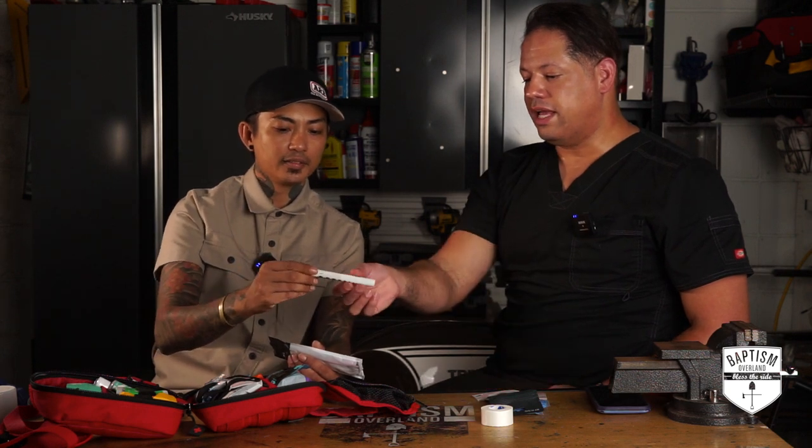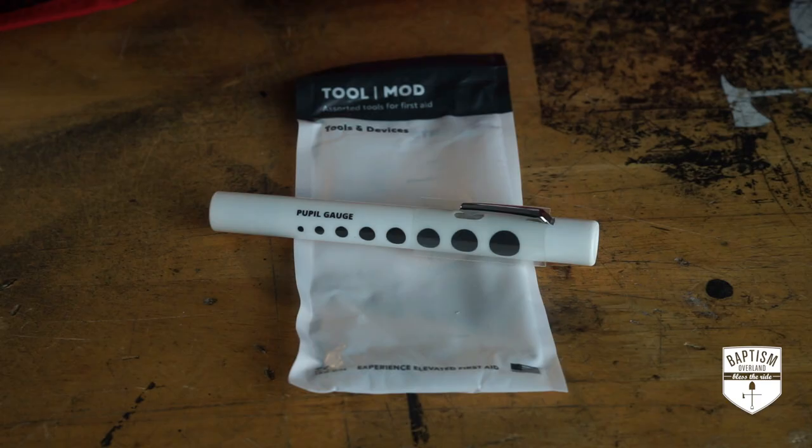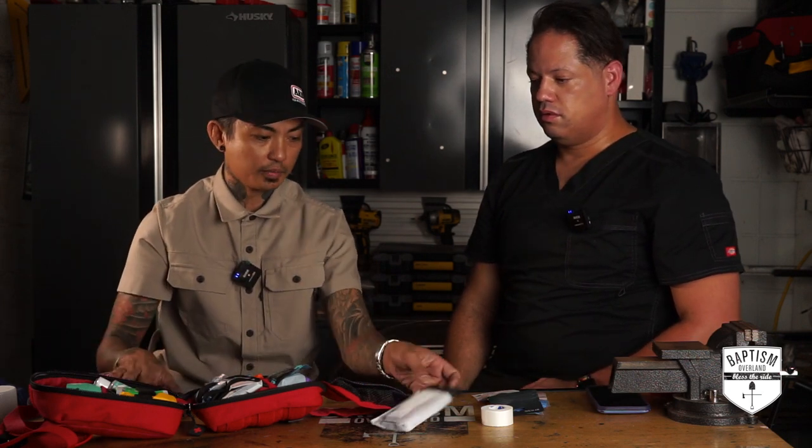What is this? It's a pen light, basically to check your pupils to see if they react to light. They actually have the pupil size guide on it so that if you need to call 911 for any reason and relay that information, you can use it as a guide. Regular kits don't have a pen light — that's awesome. I might have to buy some of this stuff for other kits.